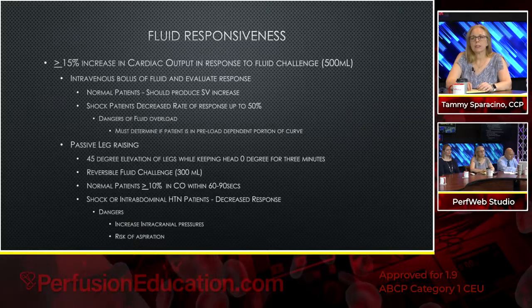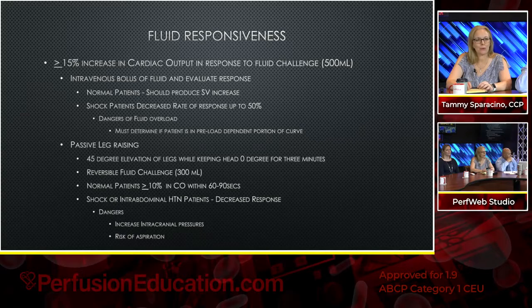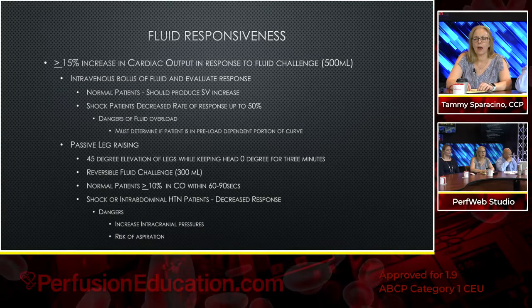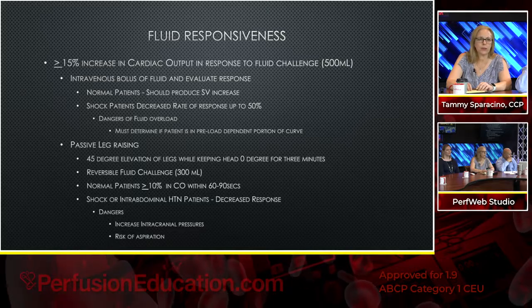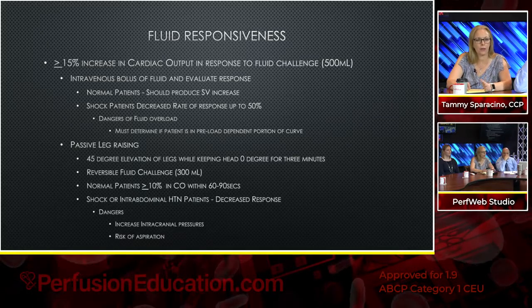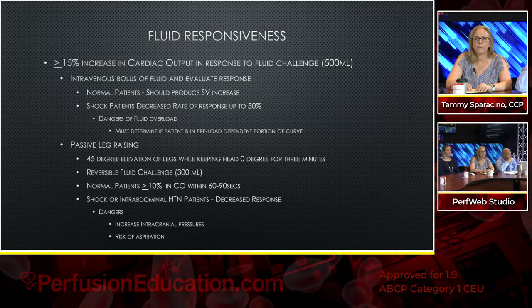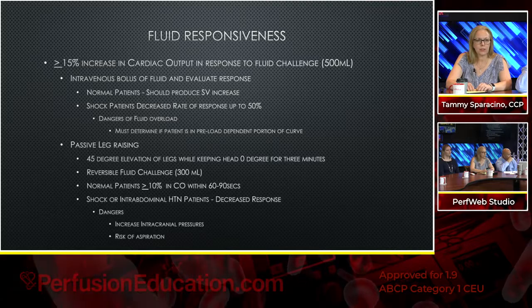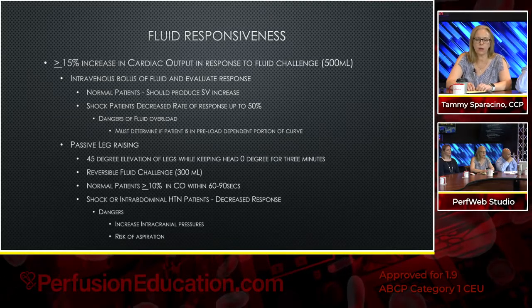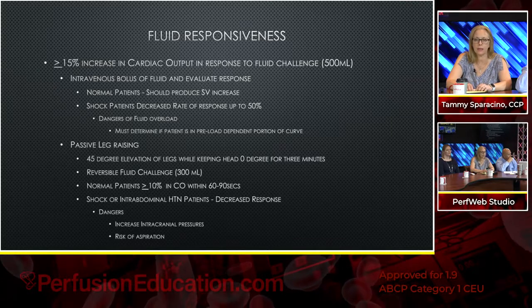Okay, this is actually something that I've heard a lot about, but I didn't actually know how it was done in the most basic terms, so I thought this would be interesting to talk about. So fluid responsiveness, we hear about fluid challenges, but I really didn't know exactly how that was outlined, so I thought this was kind of neat. So a fluid responsiveness test is just a fluid challenge. There's many ways to do it. These happen to be two of the least invasive and most common ones that are done at the bedside.